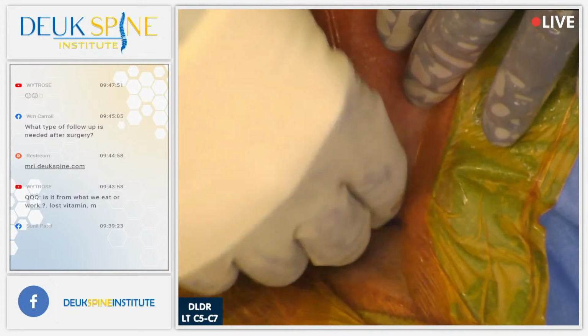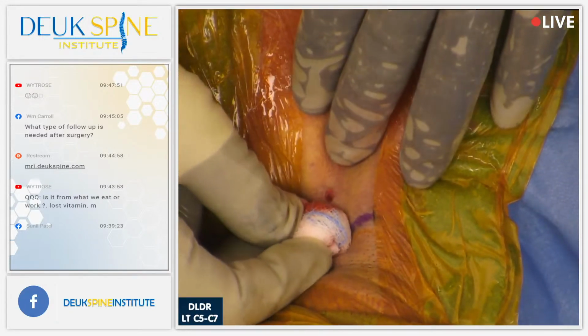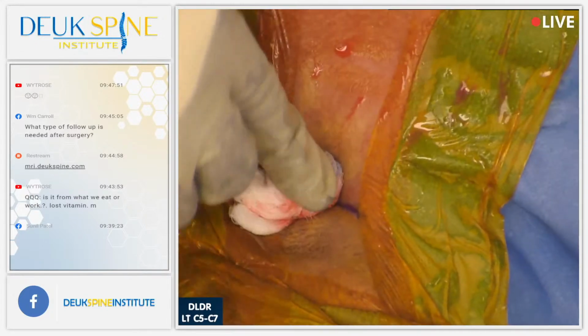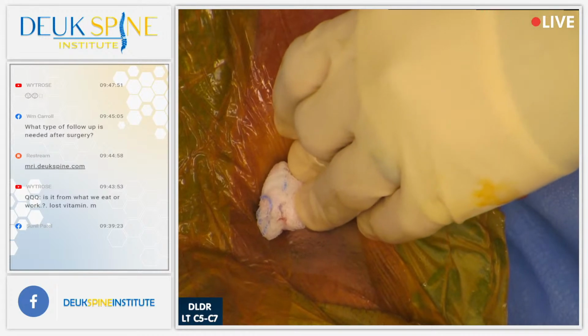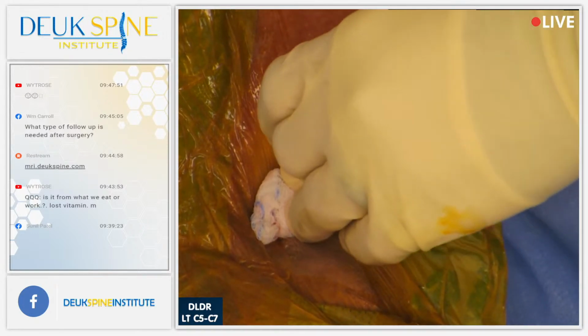Little venous bleeding. So I'm going to hold pressure for a moment, but basically you can see the incision right there. You guys see that? Yes, we do. All right, our blood loss is around 1 cc, which is around 20 drops. So when you have a little vein bleeding, you just hold pressure for 4 minutes and it stops, okay?